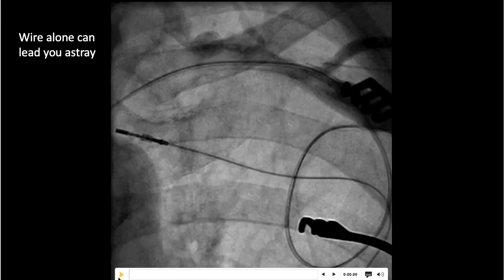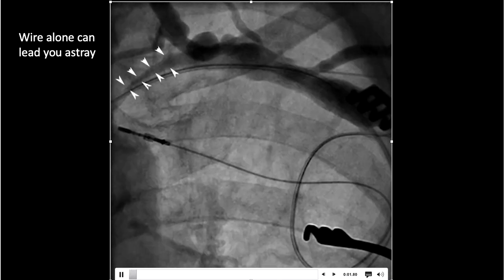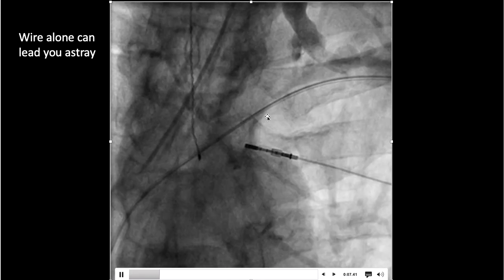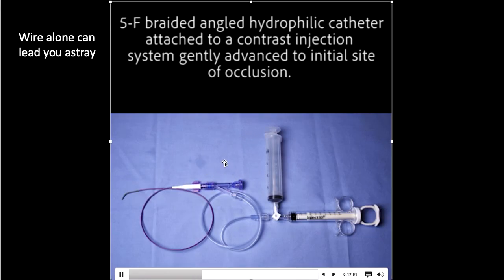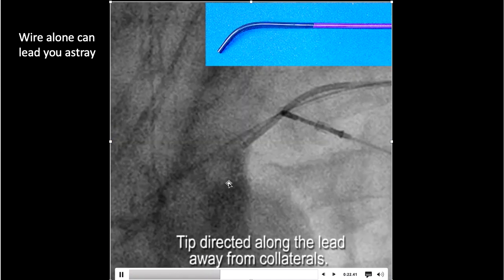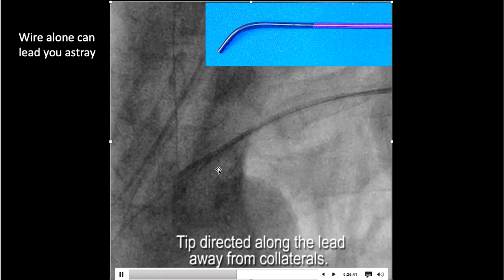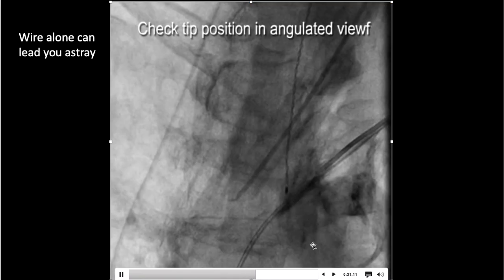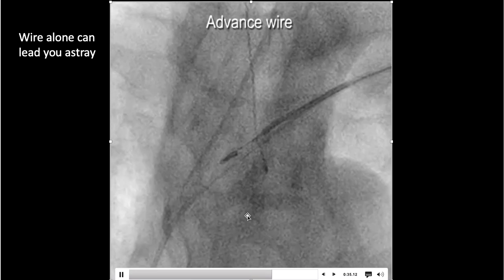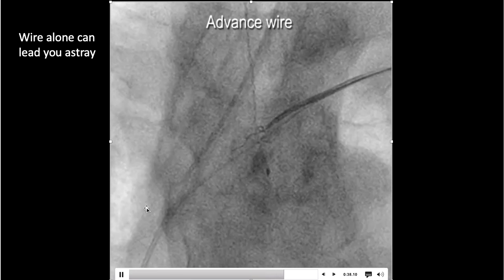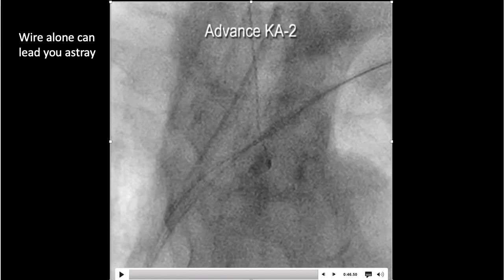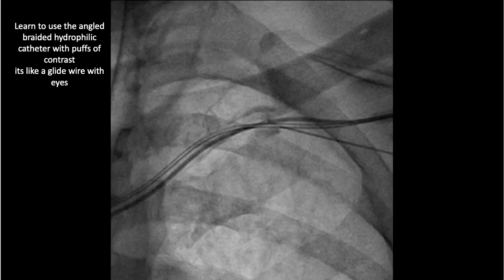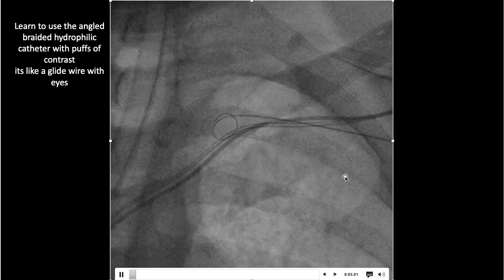One thing people don't understand is that a wire alone can lead you astray. Here the wire stopped at the occlusion and a follow-up image showed it had torn things up in the tissue. Using the angled hydrophilic catheter instead lets you stay on track, avoid collaterals, puff contrast to confirm you're in the vein, advance the wire into the central circulation, cross the occlusion, and then perform venoplasty. People think the open lumen catheter is dangerous, but it's actually the safer approach.